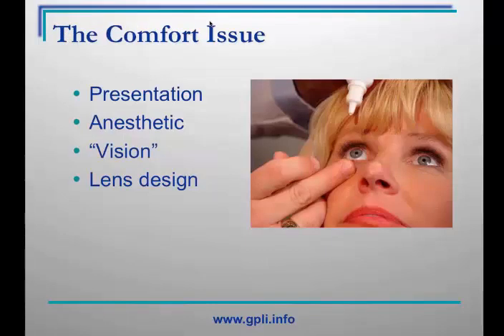I recommend a 4-step approach to optimizing initial comfort with GP lenses. The first is presentation. Use a positive approach and use terms such as lens awareness and the lid interacting with the lens as preferable to terms such as discomfort. The application of a topical anesthetic immediately prior to the initial application of a GP lens has been found to result in a significantly better initial comfort with the patient and greater likelihood of success as compared to not using an anesthetic.